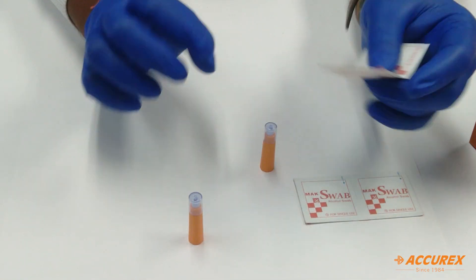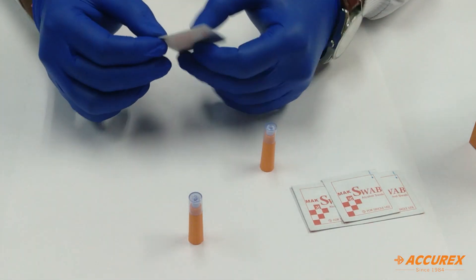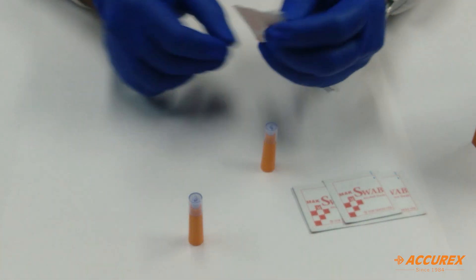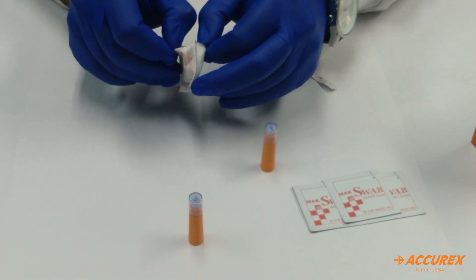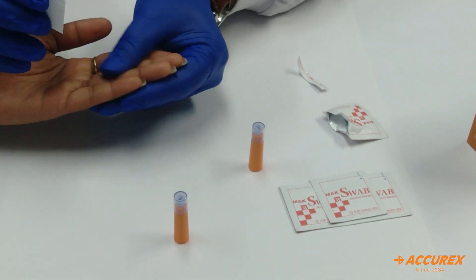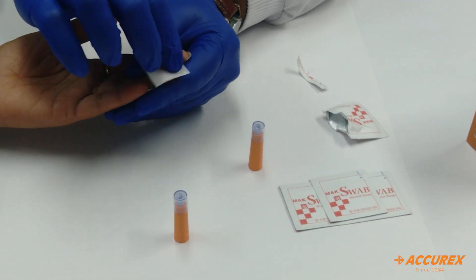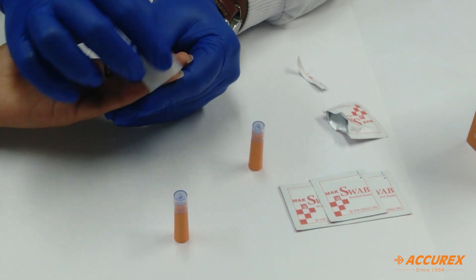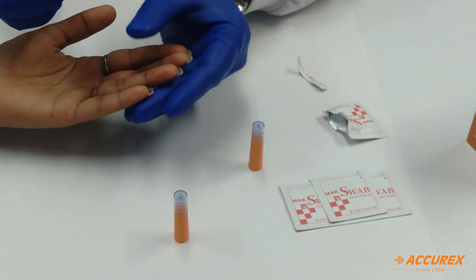This is an alcohol swab. First we need to clean the area where we need to prick with the alcohol swab. You can rub the skin with this alcohol swab properly. Allow it to dry.